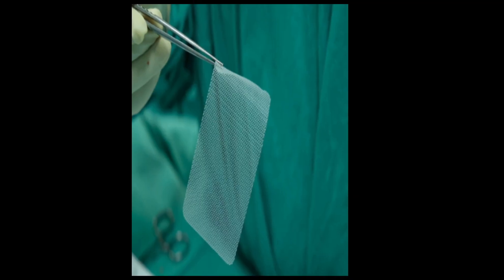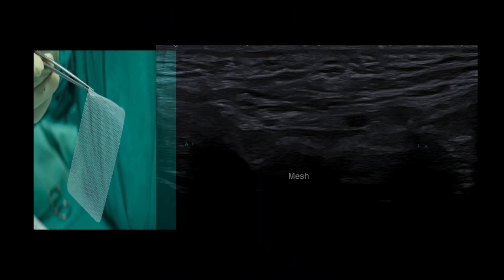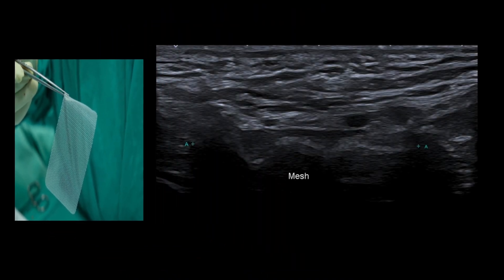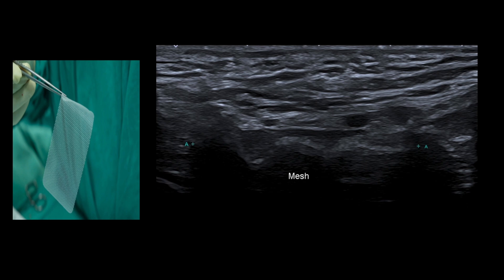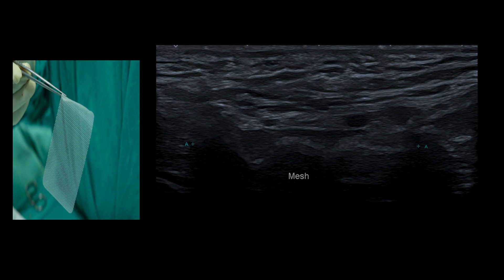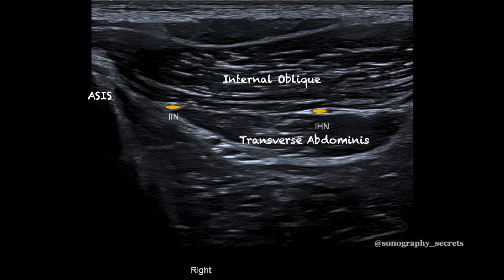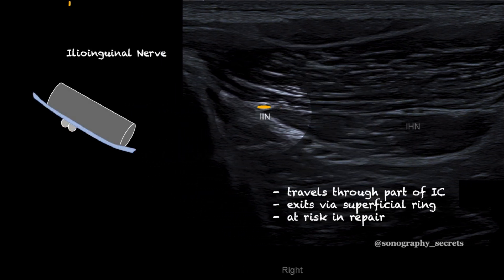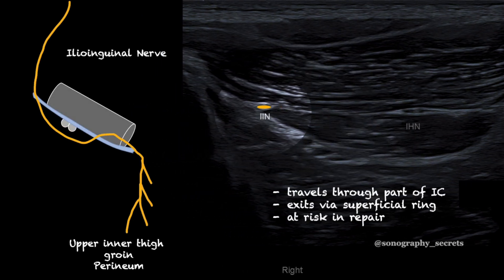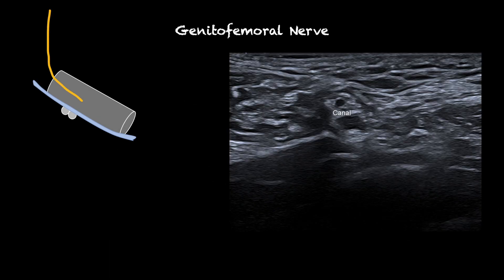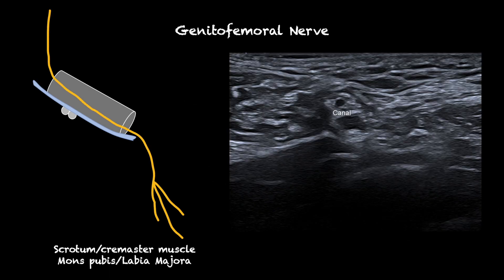Generally speaking, these hernias are repaired with mesh, and you can see by the size of the mesh why a recurrent hernia is rare. It's important to identify the mesh, and in the rare case of a recurrent hernia, this will come lateral or medial to the mesh. Recurrent pain post-hernia repair is not uncommon and can be due to a number of factors, including neuralgia of the ilioinguinal or genitofemoral nerve, where ultrasound can play a role in the guidance of injection therapy.